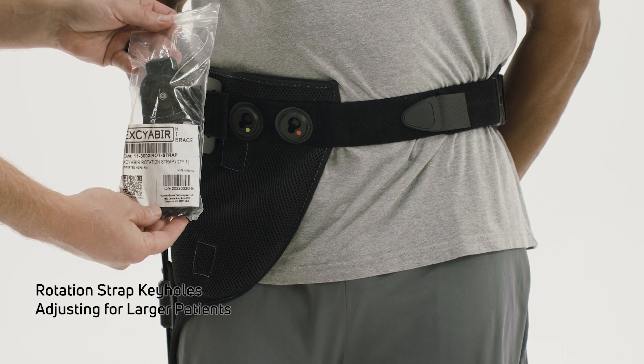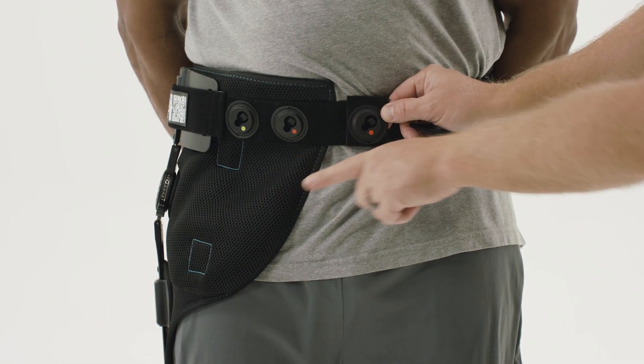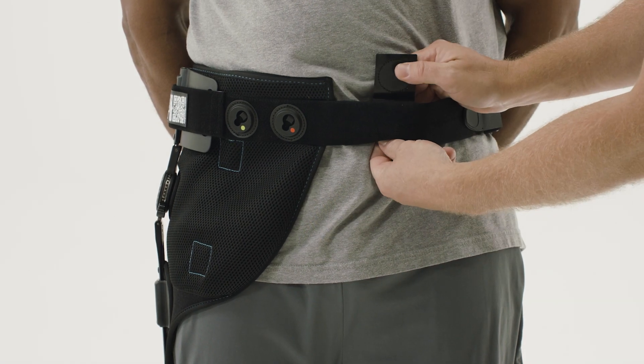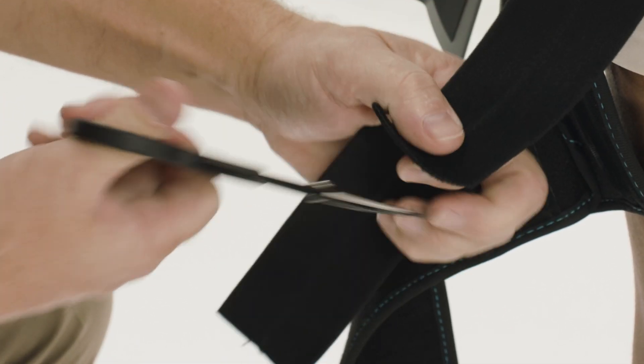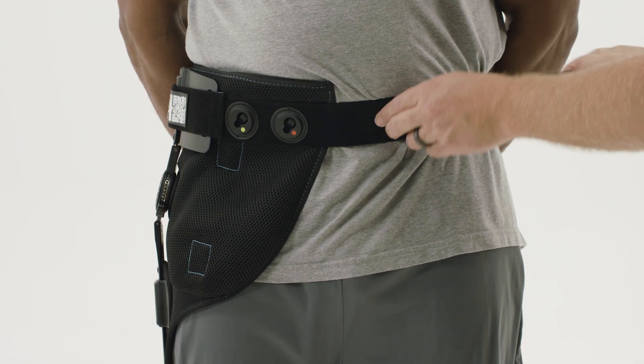Additional keyholes are included with the brace. These additional keyholes can be used to move the red rotation strap closer to or past the patient's midline to improve leverage and pull to prevent external rotation. Note: to use these keyholes, you must have a rotation strap that is not trimmed. It is best to identify the need for this prior to trimming the rotation strap.